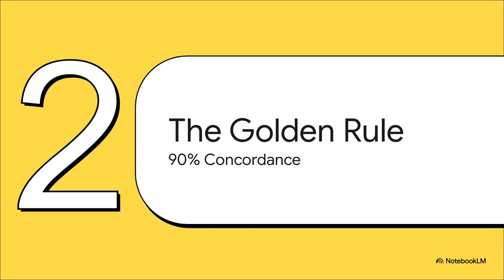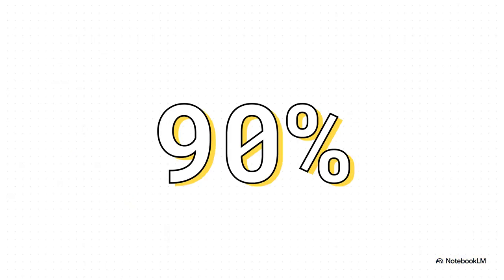All right, let's get to the main event. This is probably the single most important number to come out of this entire 2024 update. If you forget everything else, remember this. 90%. That's it. That's the new benchmark. For any test you're bringing on board, your lab has to show at least 90% overall concordance between your new assay and whatever you're comparing it to. That is the target. That's how you know you've passed.